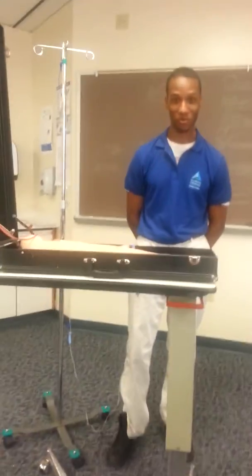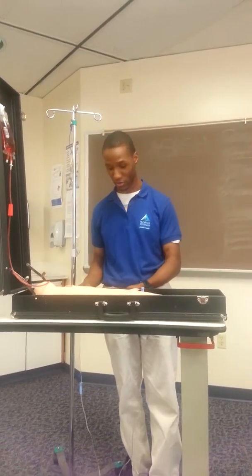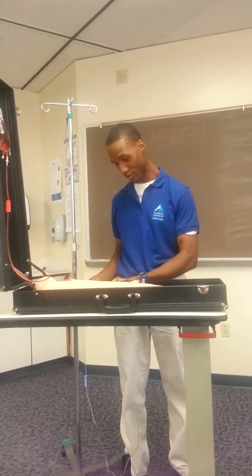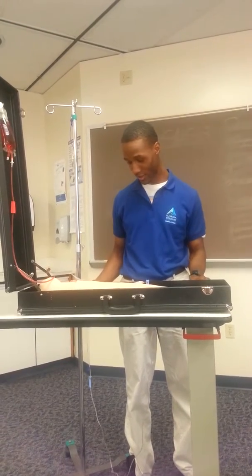Hello, my name is Samuel Humphrey, and I am in Adult Health 1. I'm in the sinks class, and I will be administering a Piggy mini bag. Now I'm in the nursing station, and I'm going over my MAR, and I'm looking at my doctor's orders. My doctor has ordered Zosyn, and I'm administering Zosyn into a 100 ml bag of saline.